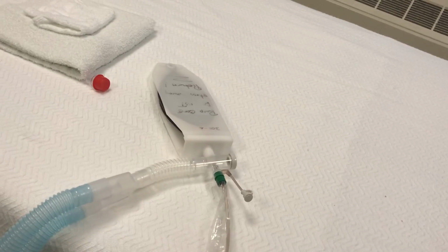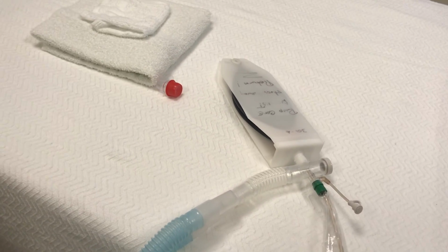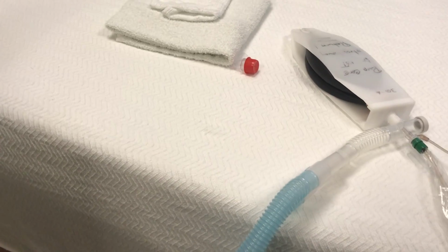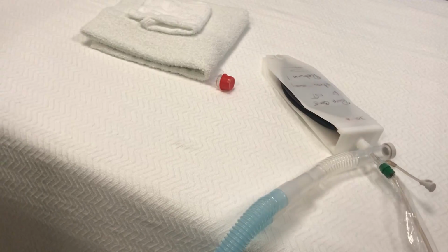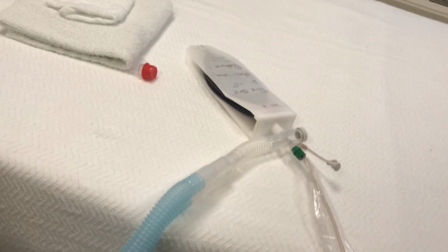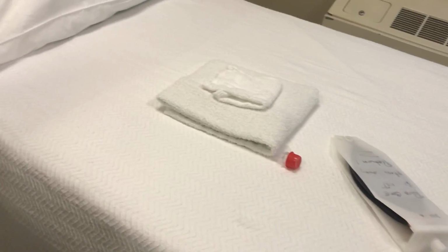So I'm going to listen for breath sounds. I'll suction you if I need to, if it's indicated. But I'll let you know after I'm done with the assessment. And then after the assessment, and if I need to suction, I would do that. I would go and check my ventilator.